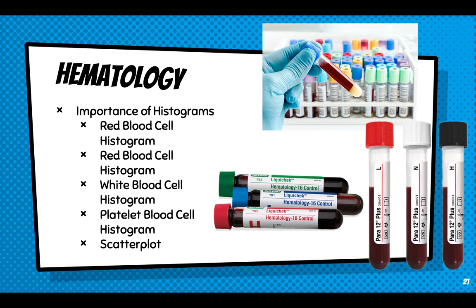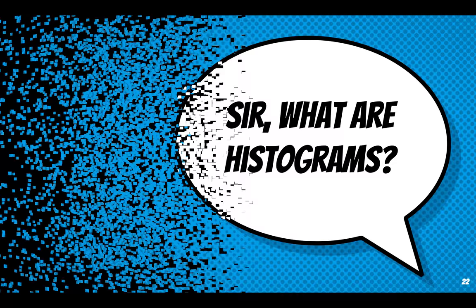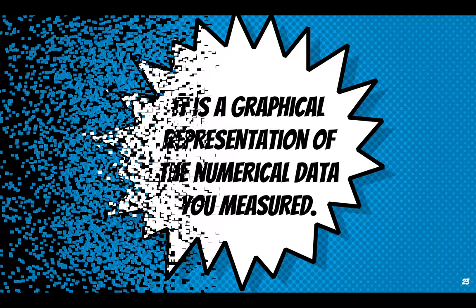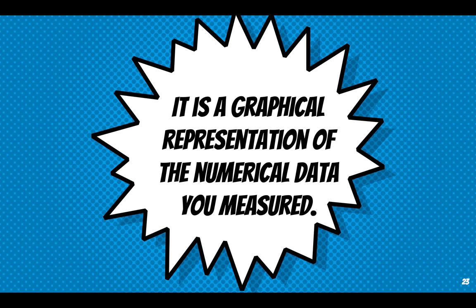So, what are histograms? We have different histograms. We have your red blood cell histogram, your white, your platelet, and also, we will be talking quickly about your scatterplot. Okay. So, let's move on now. Maybe you're asking, sir, what are histograms? So, histograms are actually a graphical representation of the numerical data that you measured.